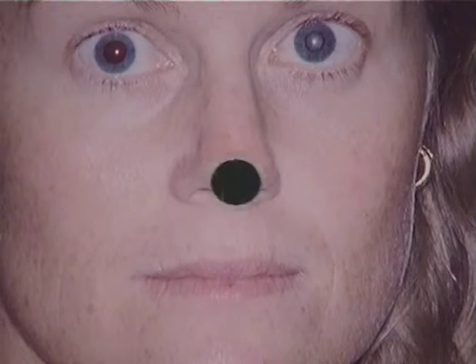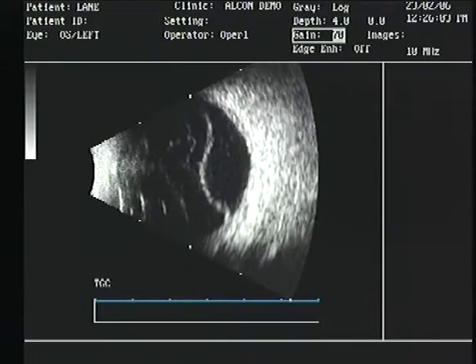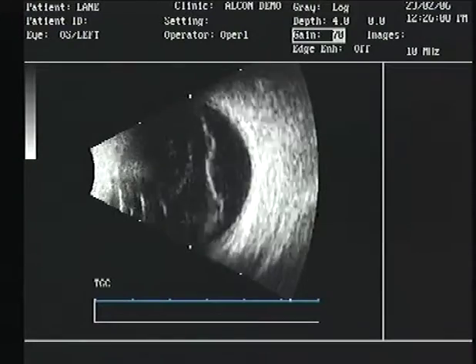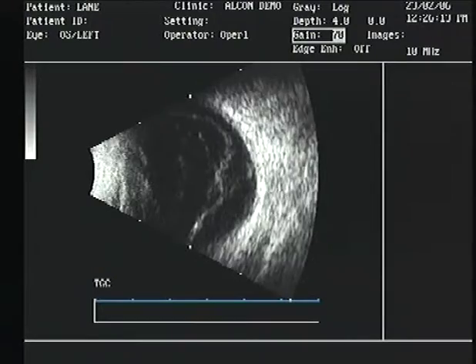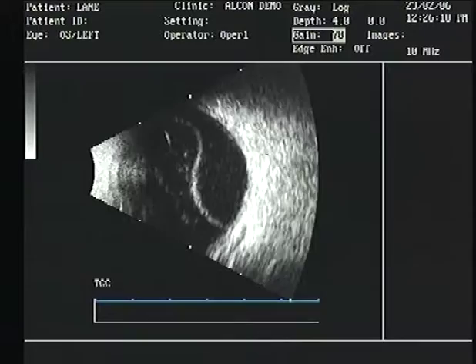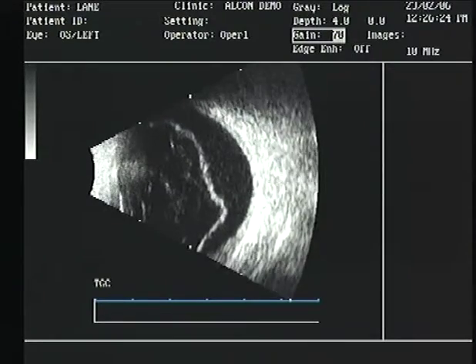The next case is a girl with a cataract in one eye. She had been supervised by her optometrist, who noticed that in the left eye there was a poor pupil reaction. Her B-scan shows a subtotal retinal detachment — subtotal because she actually had perception of light. I sent her to the big city, the cataract was removed, and the retina was put back successfully, giving her a vision of 6/36 and a full field of vision.